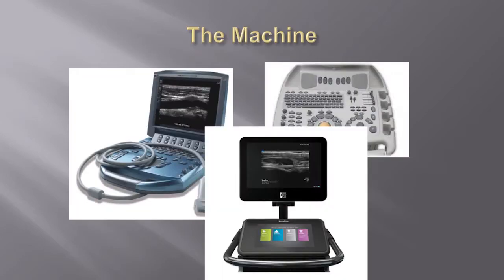All right, so these are the different machines that you'll see around. Those of you who work on the UH side of things will see this machine. That's my Sonosite. If you work at my site, Parma, you will see this Sonosite machine, which is very fancy. This is almost like an iPad. It's all touch screen and it creates wonderful imagery. Again, don't memorize the machine, memorize the function of the machine.